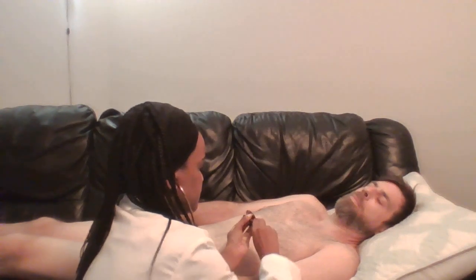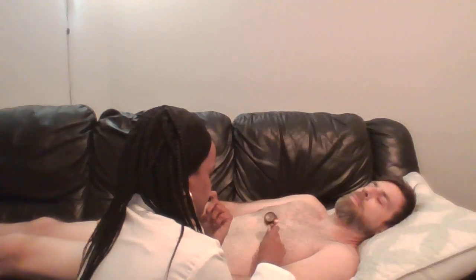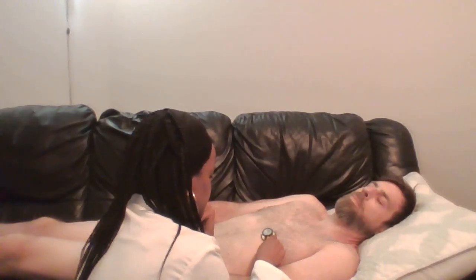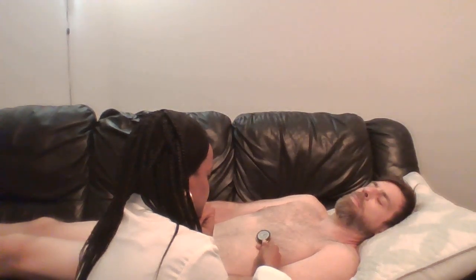Finally, the apex or mitral area, which is located at the fifth intercostal space, medial to the left midclavicular line. Back to the diaphragm. I hear high-pitched S1 and S2 sounds. Now for the bell. I hear low-pitched S3 and S4 sounds. No murmur of mitral stenosis.